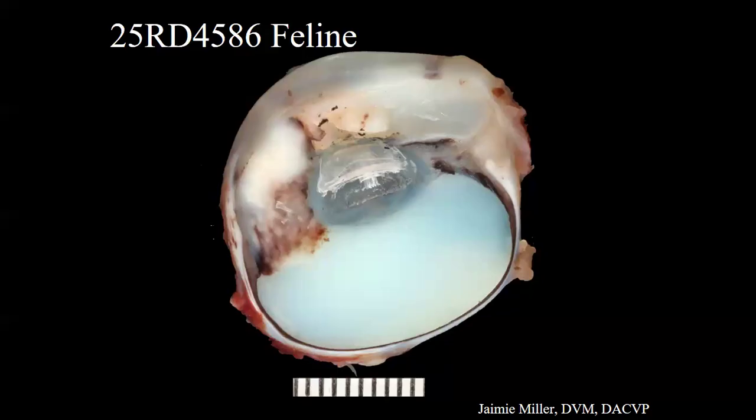So hopefully this might be sending off little bells, little red flags. This gross appearance with this cloudy gel here. How old was it again? 4 years old. 4-year-old.